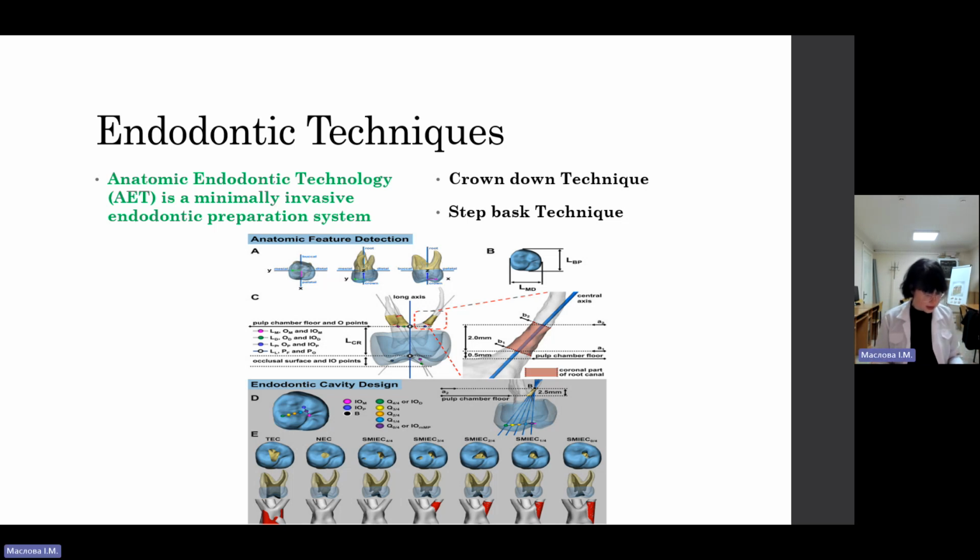The hybrid concept of nickel-titanium rotary instrumentation. For any given root canal, the use of a specific instrument X or a certain technique Y will not necessarily be successful. This is because the various endodontic systems on the market have quite different characteristics that may or may not deliver the expected result in a given situation, depending on the root canal configuration.